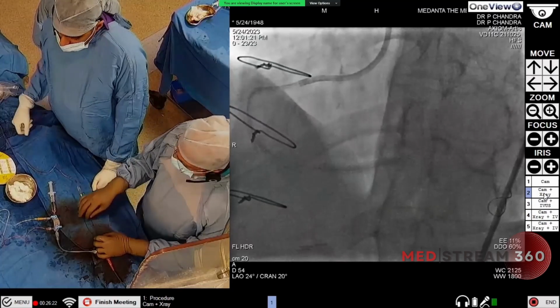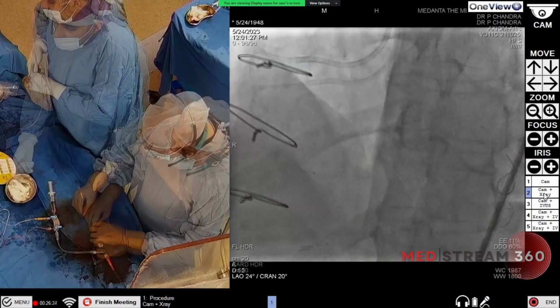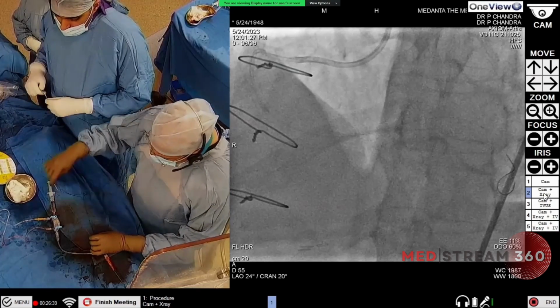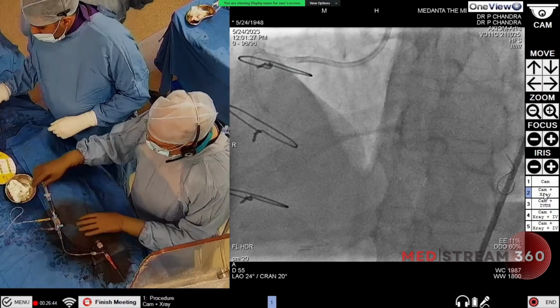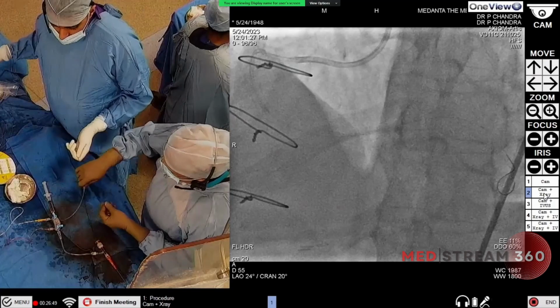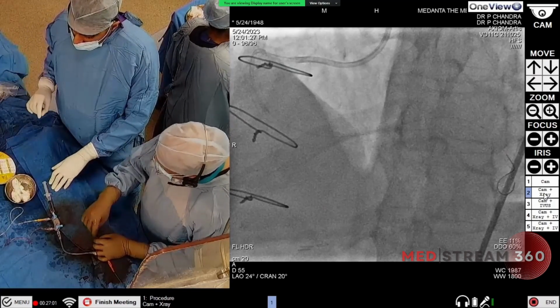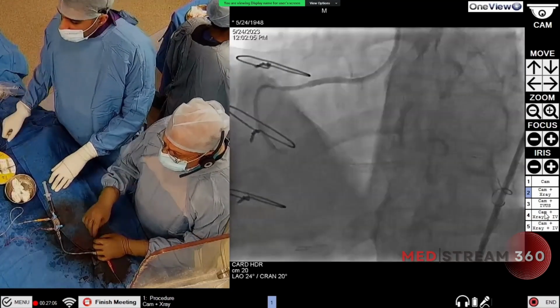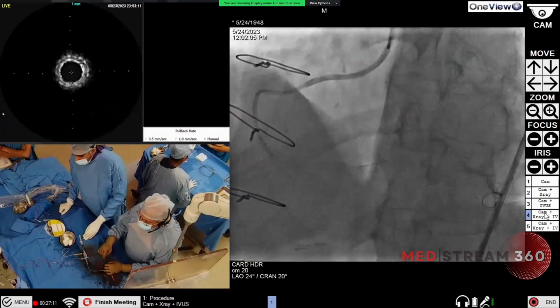Chest pain will be there because we are putting the stent. Okay. So we have to be a little careful about the distal landing zone, especially when the vessel size is tapering a little bit. With this, we can do a quick check with IVUS. Why are we doing IVUS? Why not a few more shots? Because that will avoid some contrast, and we will know exactly how much and how we have to post-dilate.